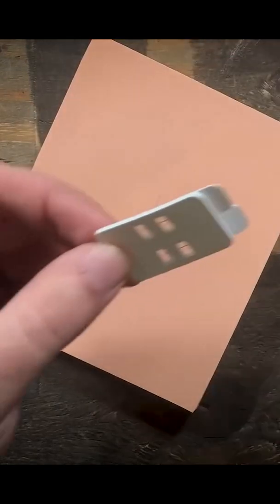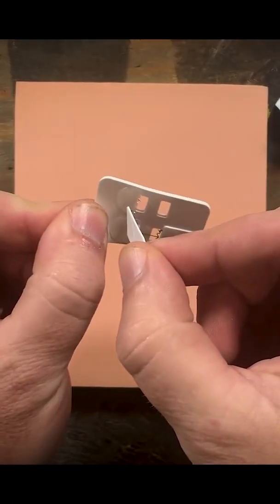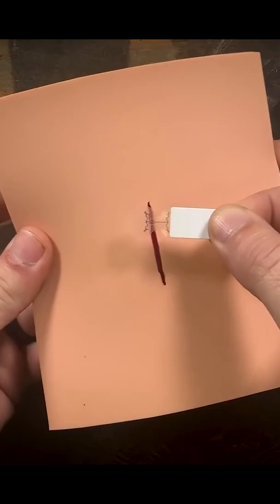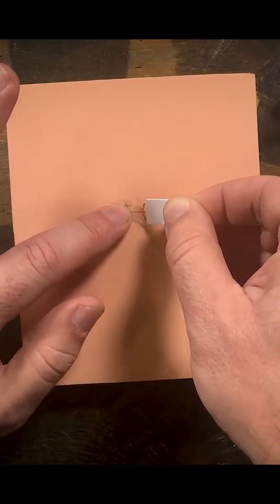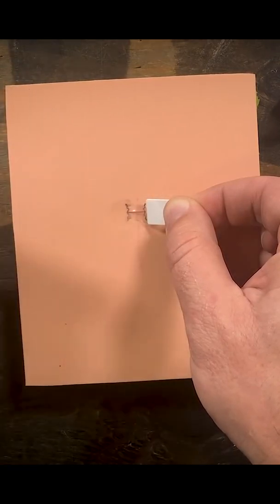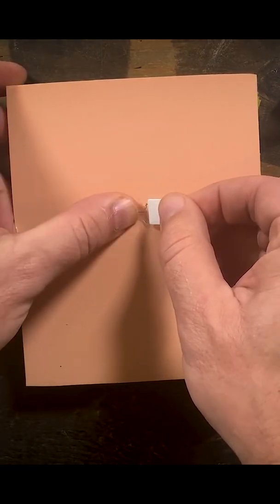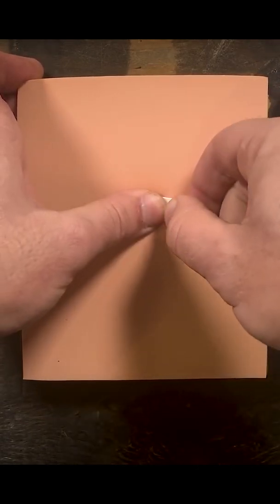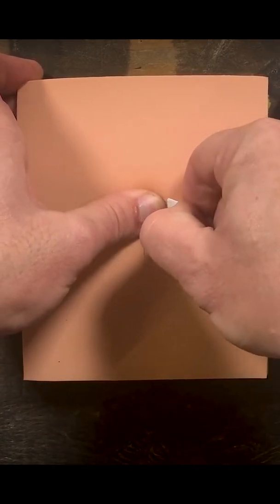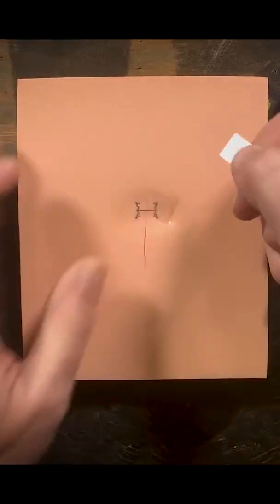You got yourself a cut. What you want to do is peel one of these off. You want to place this over your wound and press, and you want to put pressure down and towards the wound. And then you pull across, some pressure to here, and then pull that tab while keeping pressure on the other side.